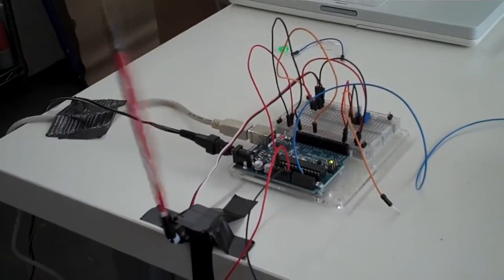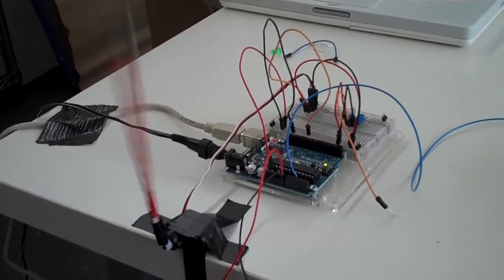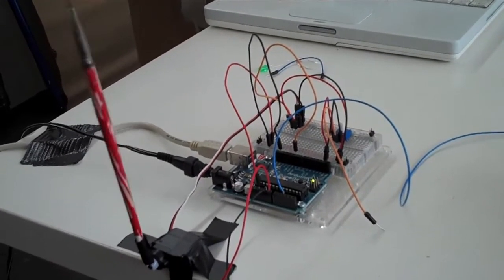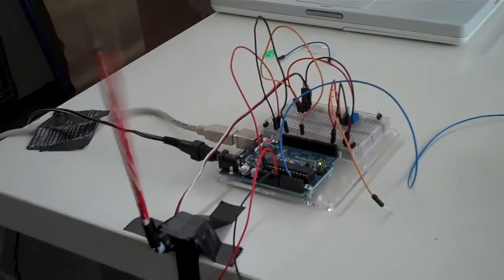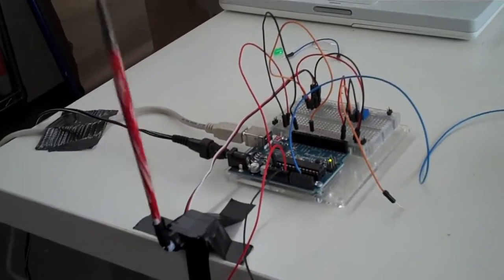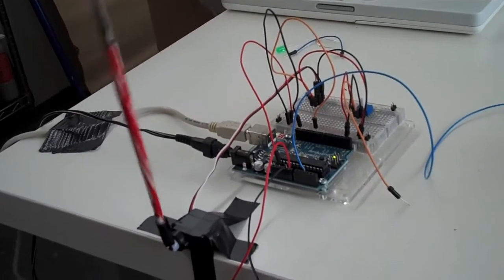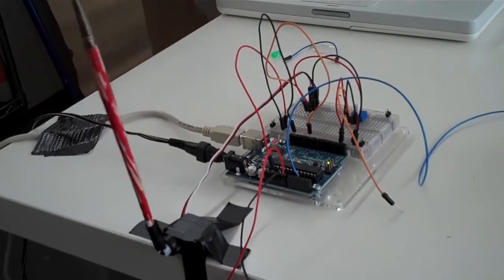This is the Arduino running the servo. The Arduino is taking as an analog input the output from the differential pressure sensor, which has been amplified. Its normal point is 2.5 volts, and exhaling and inhaling changes the pressure up and down. So the voltage variance at the moment is about plus or minus 1 volt either way.